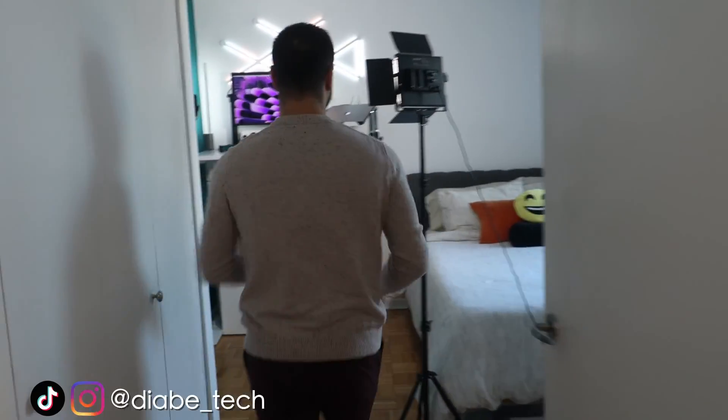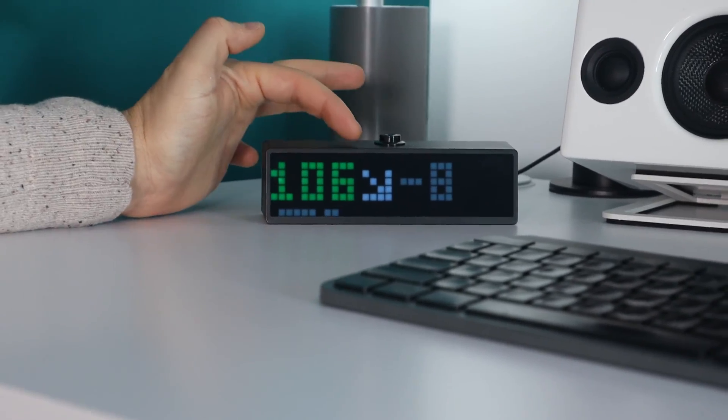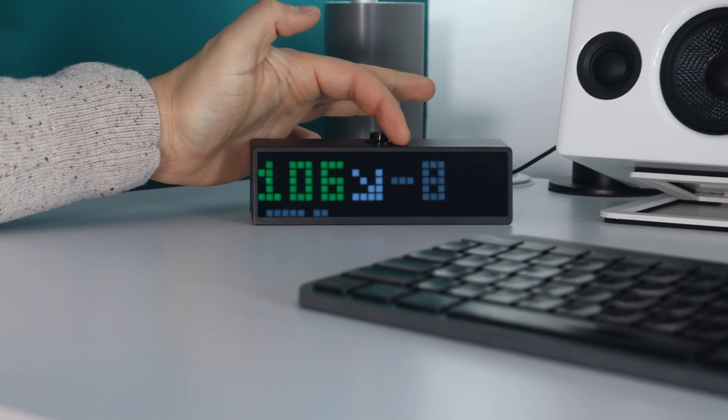Let's start with the first one at my desk. This one right here is called Sugar Pixel. It's showing my blood sugar levels right on it. I'm at 106 — I'm in the green range.